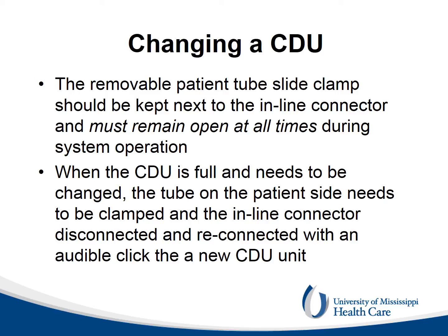When the CDU is full or broken and needs to be changed, before disconnecting the CDU, the chest tube needs to be temporarily clamped to the patient in order to prevent a pneumothorax. Otherwise, the chest tube and the tube connecting to the CDU should be left open at all times.